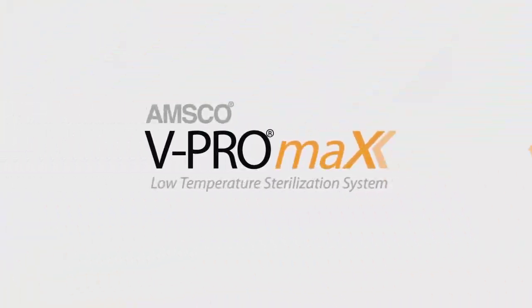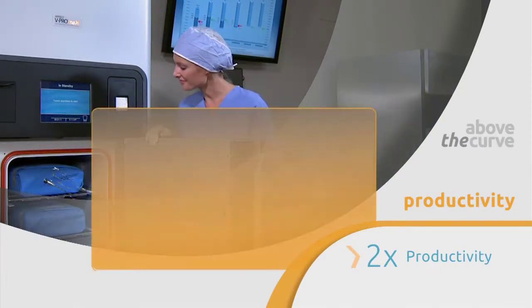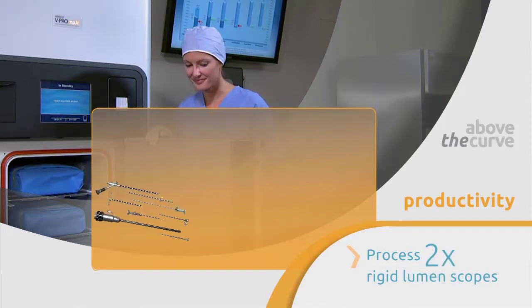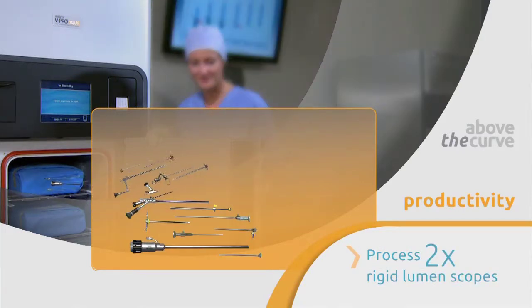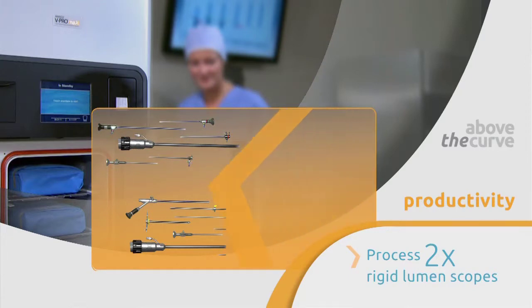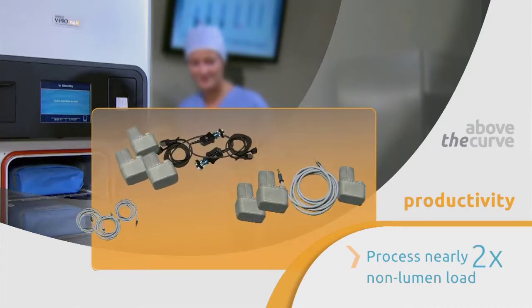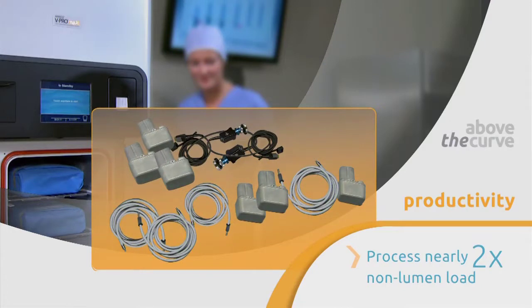The V-Pro Max productivity advantage puts you above the curve by allowing you to process more devices in less time. With the lumen cycle, you can process up to 20 stainless steel lumen devices in 55 minutes. With the non-lumen cycle, you can process cameras, batteries, and light cords in 28 minutes.